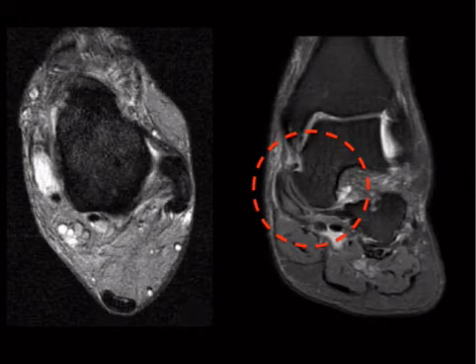I'll give you an example of another sequence. First, you get the money, then you get the power, then you get the women. That would be an example of another sequence. So just like that, we are going to look at the medial ankle sequence.